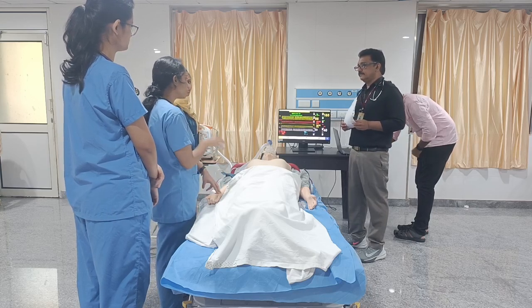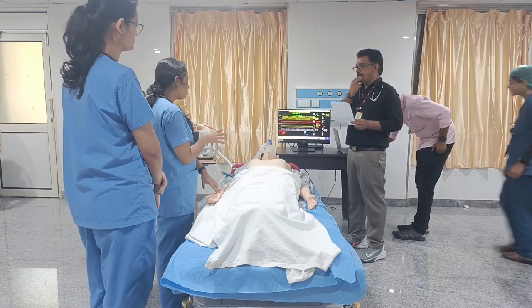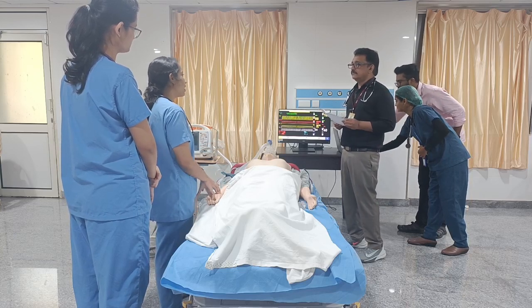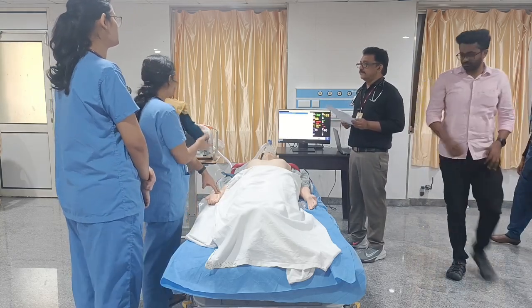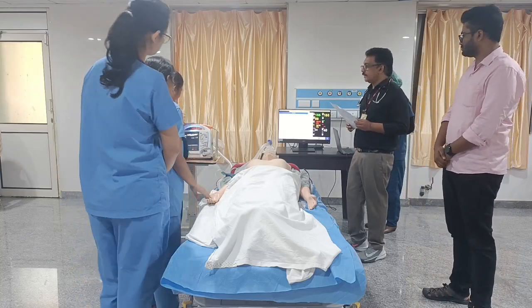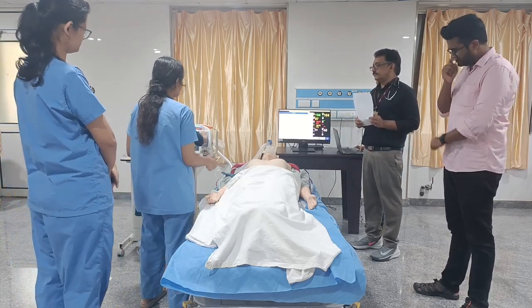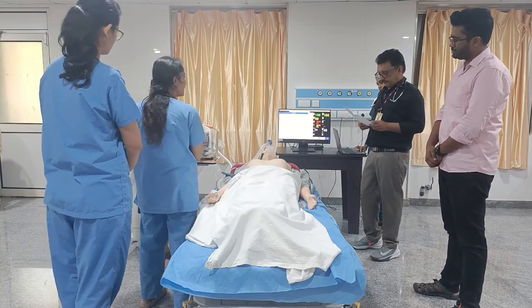Since the ECG is showing an irregular narrow QRS complex with no morphological P waves, we should consider the patient to be in unstable AF, and in unstable AF we will have to go ahead with synchronized cardioversion. So we will get ready with the defibrillator and connect the patient to it. Tell the technician to connect and charge the defibrillator, and you can give the shock. Since it is unstable AF, we will give synchronized cardioversion, so we will have to press the sync button.